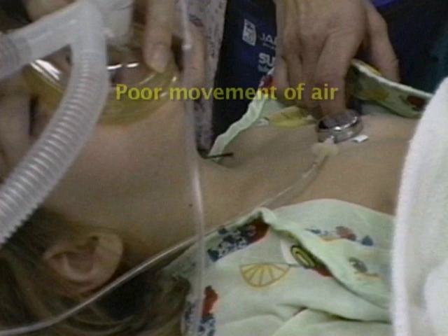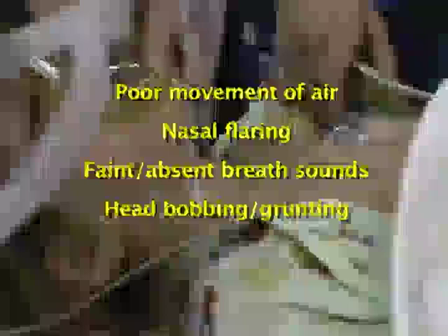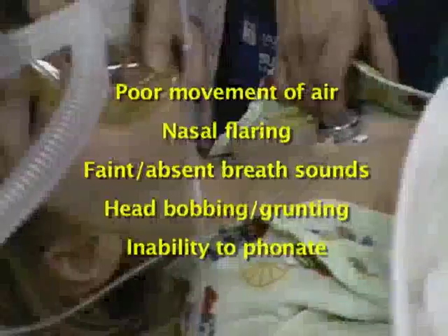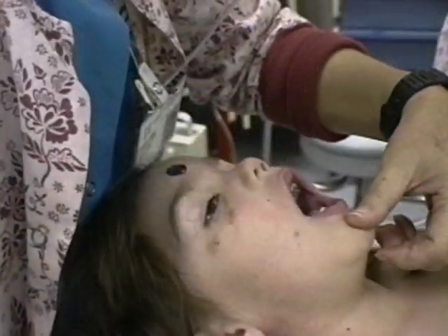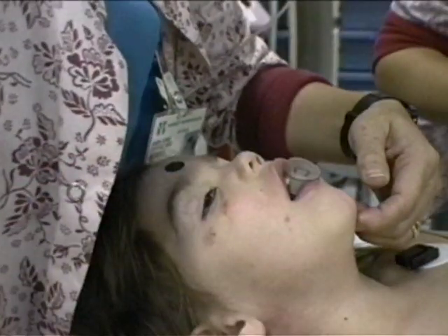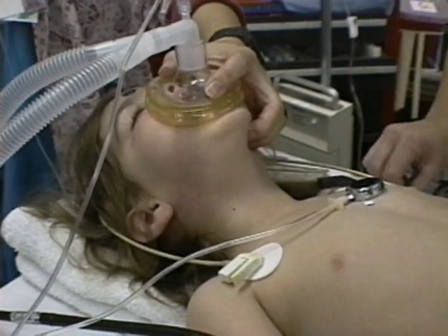Other signs of airway obstruction can include poor movement of air in and out of the mouth and nose, nasal flaring, faint or absent breath sounds, head bobbing or grunting, and the inability of the awake patient to phonate. The provider opens the airway by pulling up on the jaw, then inserts an oral airway. Look at the difference in chest wall motion now that obstruction is relieved.